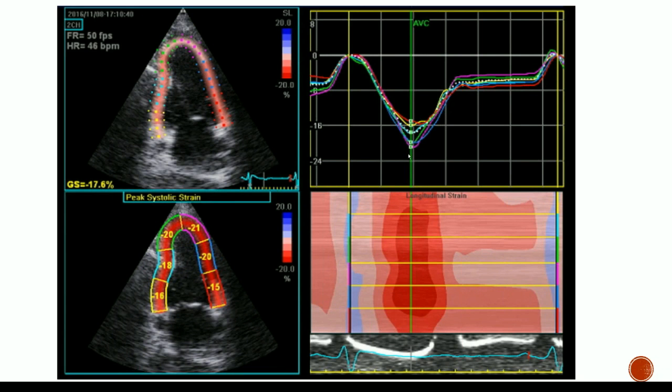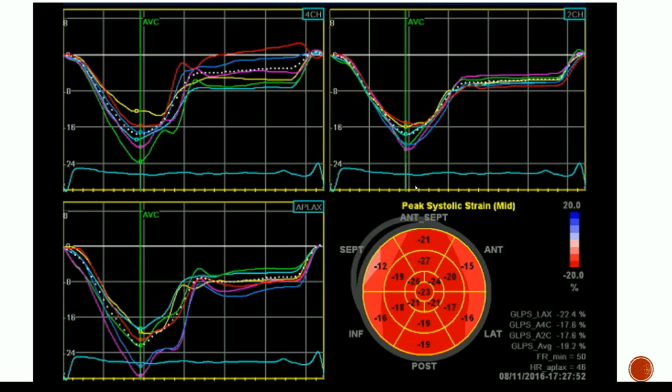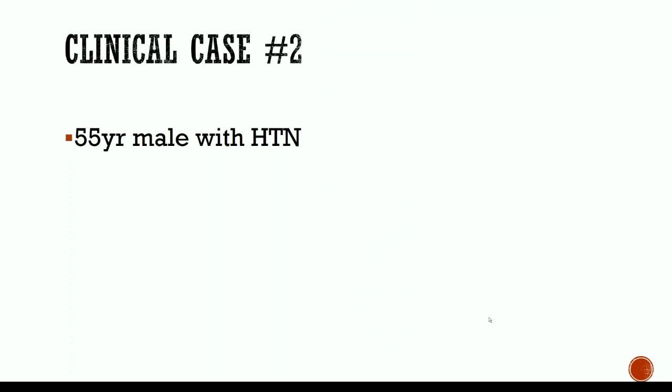One of the other things I didn't mention is for cardiac resynchronization, you want these all to line up together. You can also look at dyskinetic segments with a strain pattern that may peak earlier or later, indicative of dyssynchrony of the myocardial tissue itself. So again, his same values put on the polar map, with pretty normal strain.